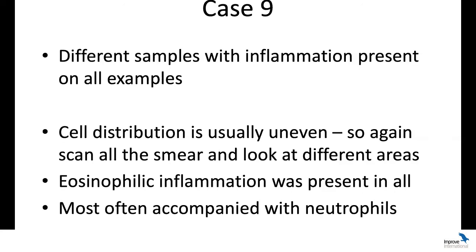So we often describe that as a mixed cell inflammation. But then we say, well, with lots of eosinophils, so predominant eosinophilic and neutrophilic components. So it's not that I have all of the inflammatory cells, it's that I have these two cells coming through. So when this happens, we have to think about what are the different sets of differentials that we have for each one of them. And because the eosinophilic inflammation has a more restricted number of different differentials, then that's often where we should go with our list of differential diagnosis.